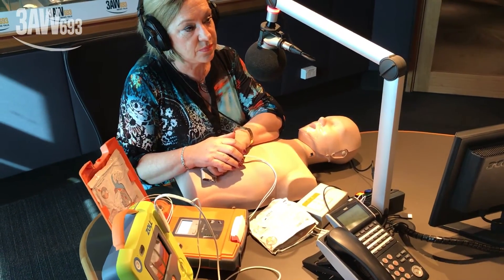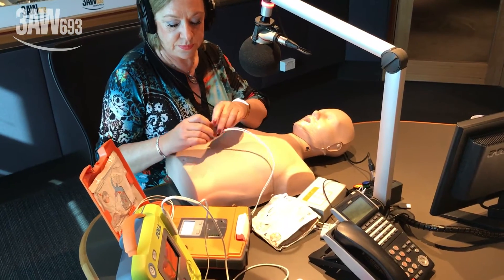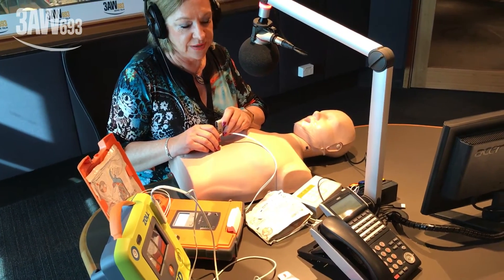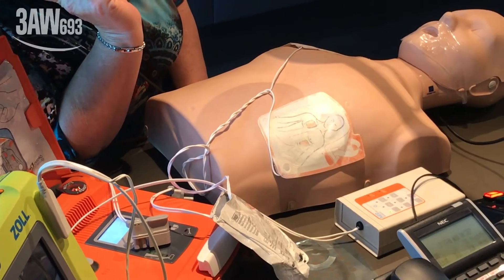The AED instructs: 'Begin by exposing the patient's bare chest. Remove or cut clothing if needed.' You can see it tells you everything you need to do. When the patient's chest is bare, open the white package across the dotted line and remove the pads.